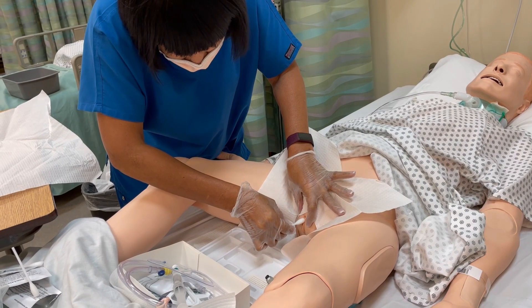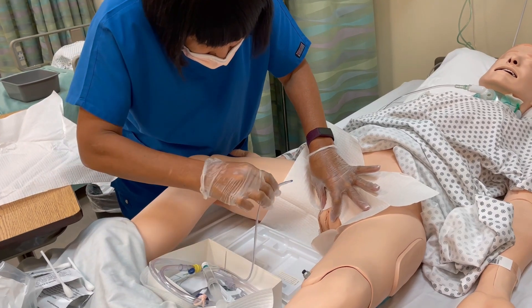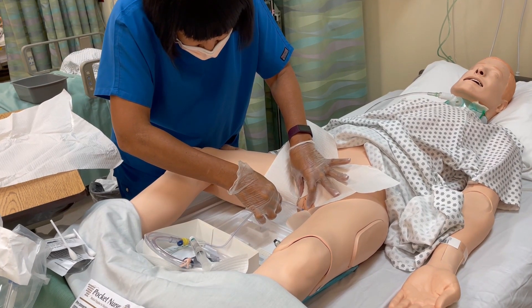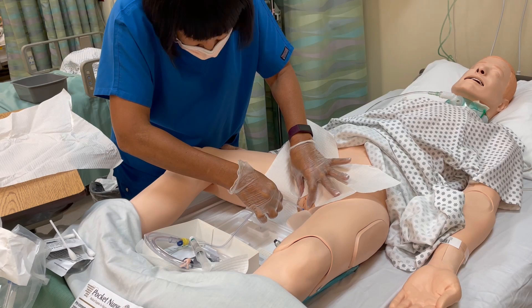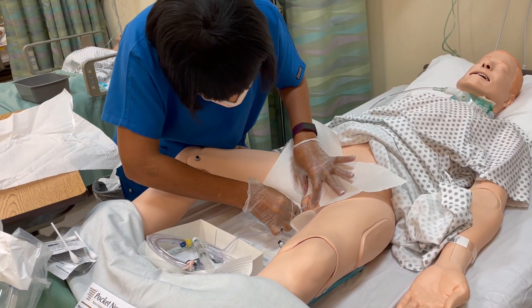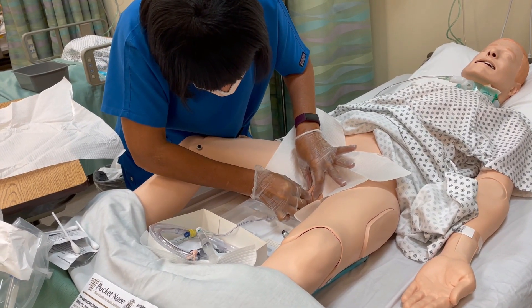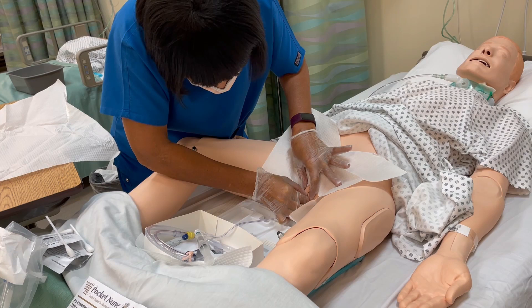Right in the middle here, I'm just going to clean it. Clean it a little — very good. So now I'm ready for you. I'm going to hold it down. Here's mistake number ten: her grip on the catheter is too far back to maintain control, which is allowing the catheter to rub against the skin and become contaminated before going into the urethra. Here's mistake number eleven: her sterile hand is hitting into her contaminated hand while she is pushing the tubing into the urethra.